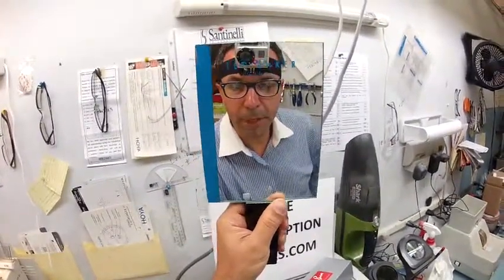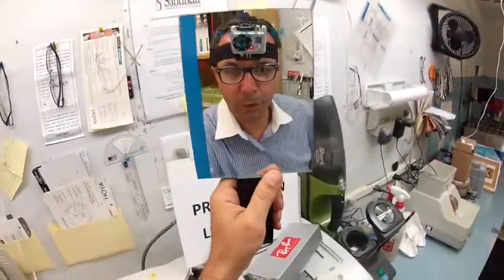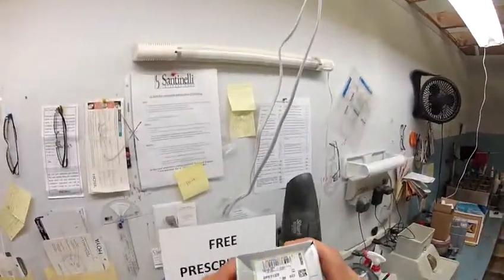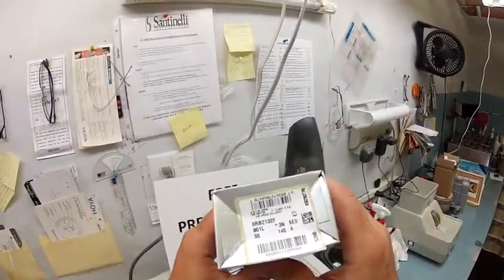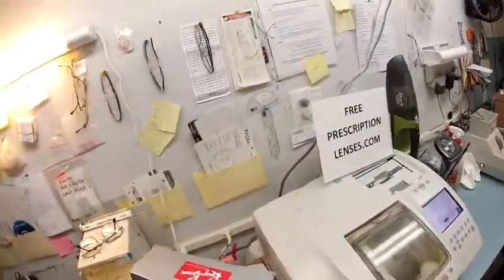Hey Bob of Done Right Services. This is Matthew with FreePrescriptionLenses.com and I'm going to show you how I cut bifocal transition lenses for your brand new Ray-Ban 2132, the new Wayfarer, color 901L, which is the classic black in a 55 eye size. Let us begin.